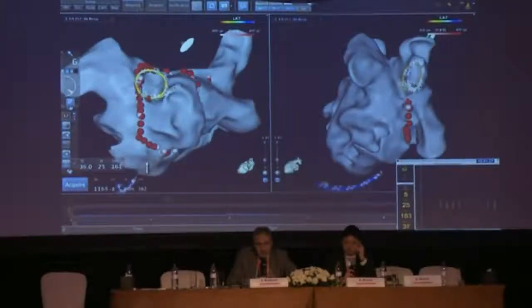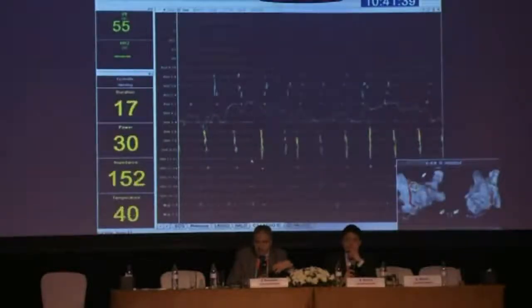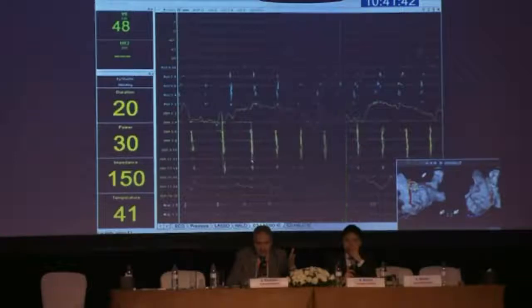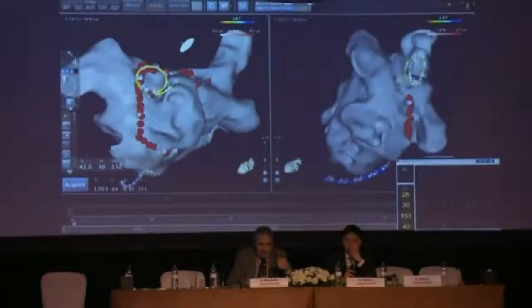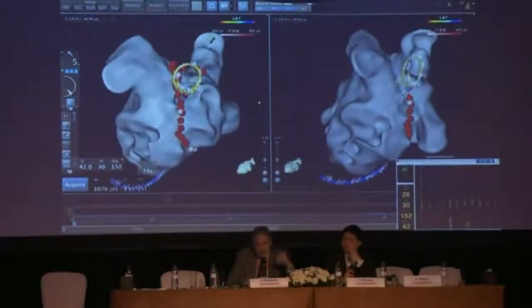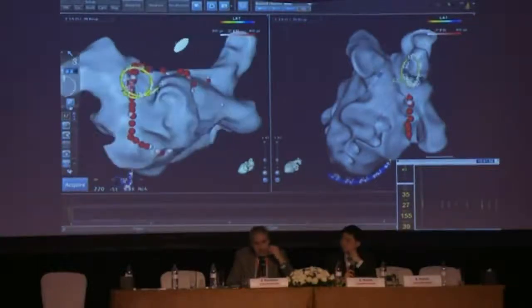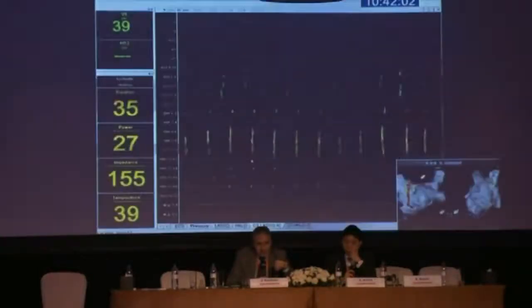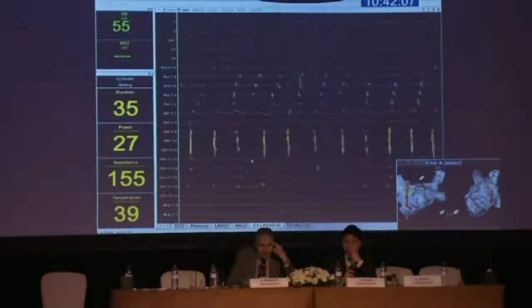Yeah, this is very important. Again, here you can achieve very good stability within this area with Hansen. It's usually a very thick area because it's like a triangle, like a pyramid between the superior, inferior vein and the appendage, and there is a lot of epicardial input from that area into the vein. So I think here you have to do it from the venous side, otherwise it's very difficult to get rid of this. We don't see the signals very much. Maybe if we can enlarge the screen with signals. Yeah, big signal. That's great.